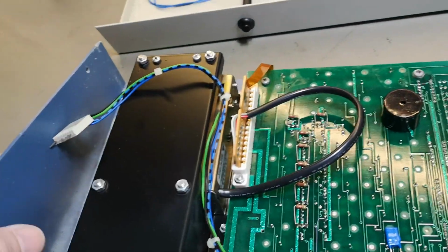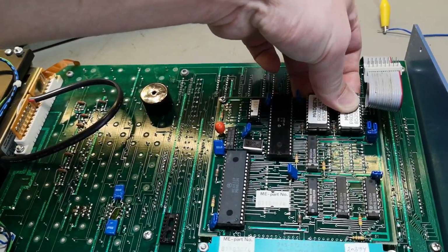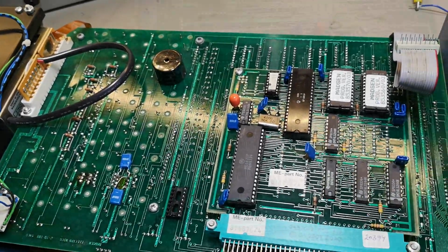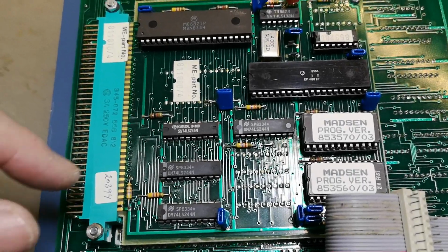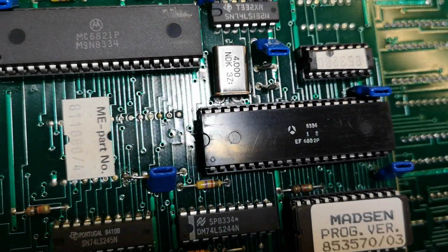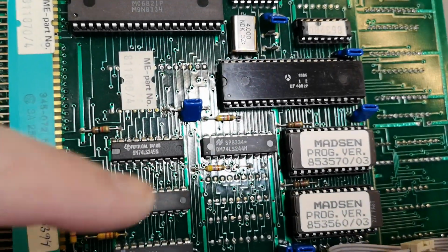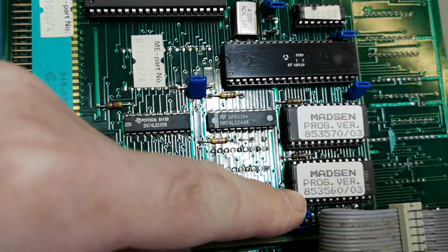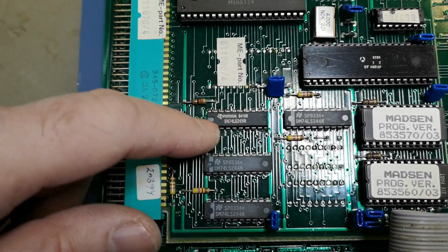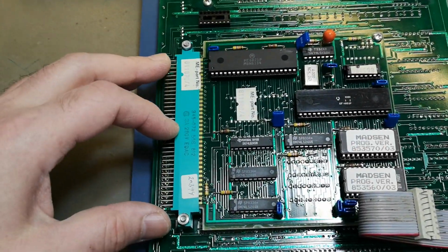Maybe if I disconnect that connector to the printer, then I will be able to see if there's any voltages and stuff going on here. What is that? So this is a 6802 CPU, and it's from 1983. The software is 85. Yeah, 83 on the other parts, 84. So yes, this unit must be from 85 due to the software versions, right?